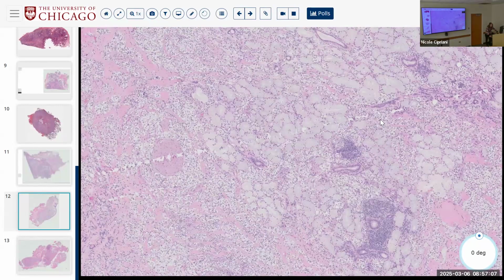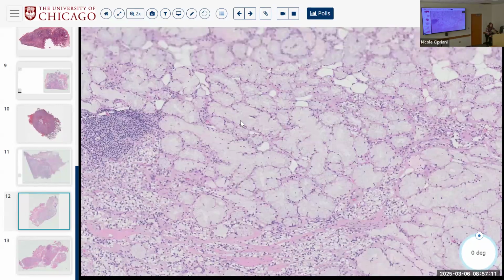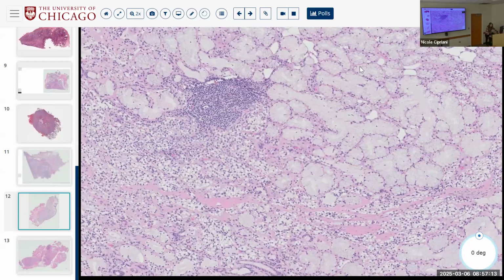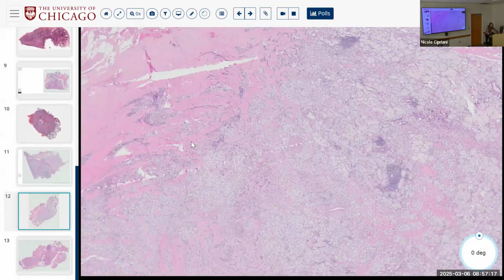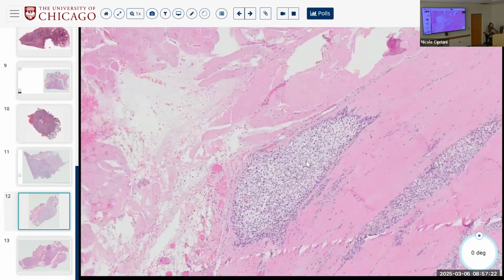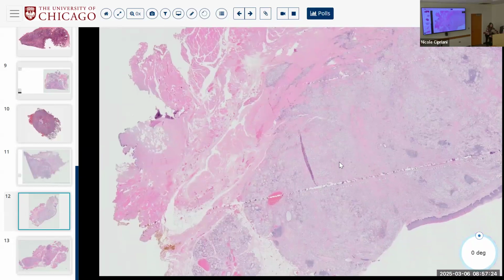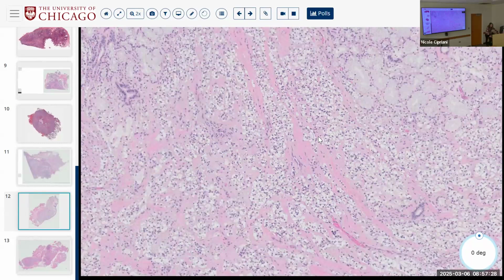Infiltrative or not infiltrative? Highly infiltrative, right? This thing is percolating out into the adjacent mucinous salivary tissue. It's dripping down into the fibrous stroma. All right, so malignant. Look, there's even a nest out here. All right, so we talked about what your differential could or should be if you have abundant clear cells.